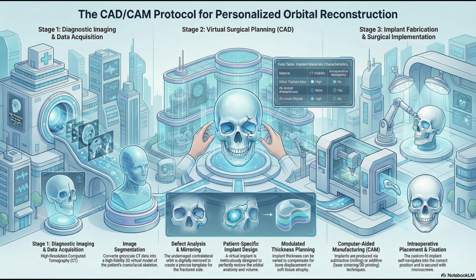And I'll conclude by saying that while that data integrity is the ticket to entry, you can't even start the process without it. It's the ability to navigate all the subsequent complexities that truly defines success or failure. This means making that conceptual leap for hypercorrection, managing the critical trade-offs with materials, and at the highest level, integrating the implant with advanced surgical technologies like navigation. These are the steps that demand a true mastery of both engineering and clinical prediction, and that's where the greatest challenge lies. I think we can both agree that this entire individualized CAD-CAM protocol is a paradigm shift in our field.